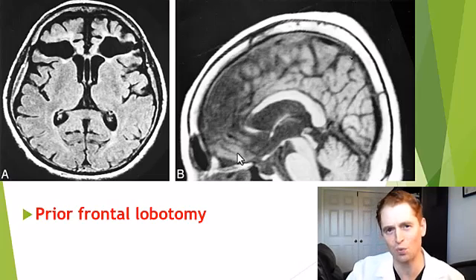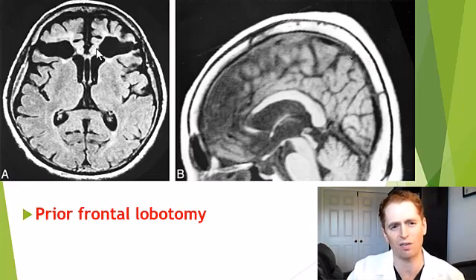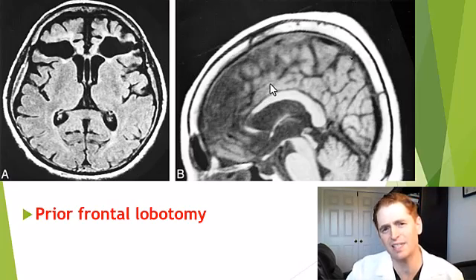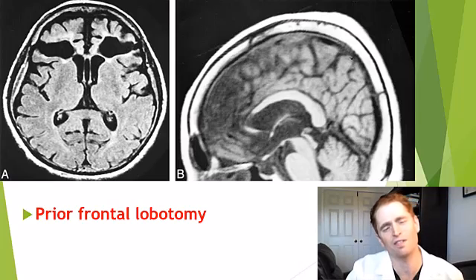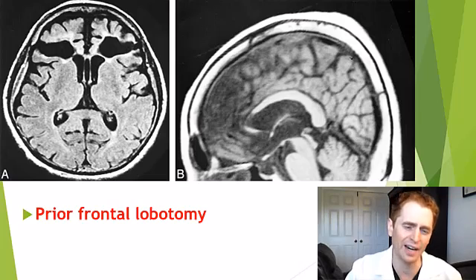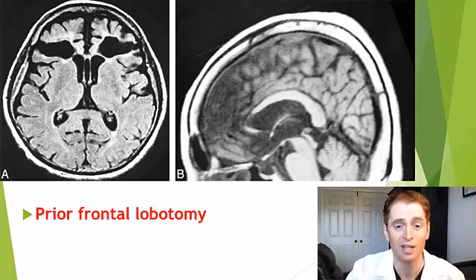If you couldn't get this last one, don't fault yourself — there isn't really a disease that causes these unusual, symmetrical areas of gliosis in the bilateral frontal lobes. This is actually caused by humans who used to perform frontal lobotomies to treat psychiatric disease. Lobotomy did work in treating agitation, but led to terrible personality changes, mood changes, dementia, and often progressive symptoms down the line.